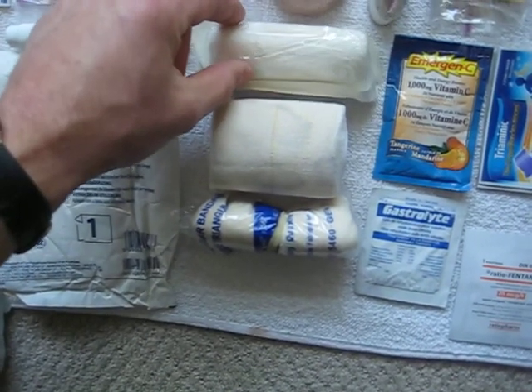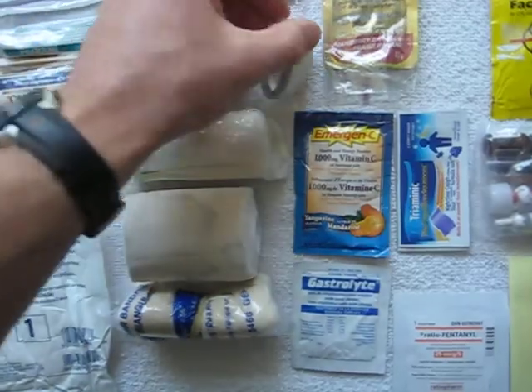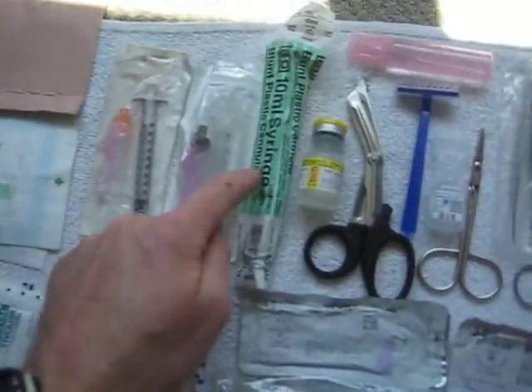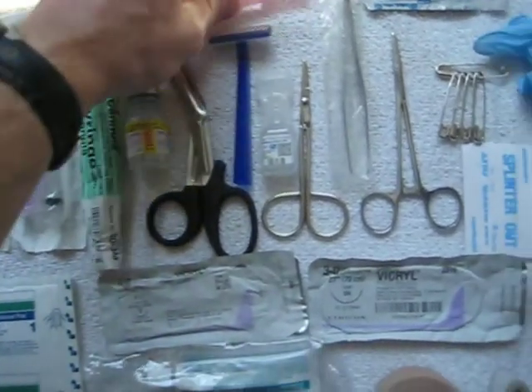This is a sterile gauze roll. Basically some Coban tape and some transport tape. And that's pretty much it for bandaging. I got a 10 ml syringe with irrigation saline and also a saline nebule.